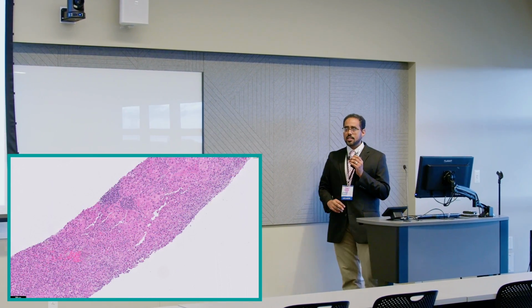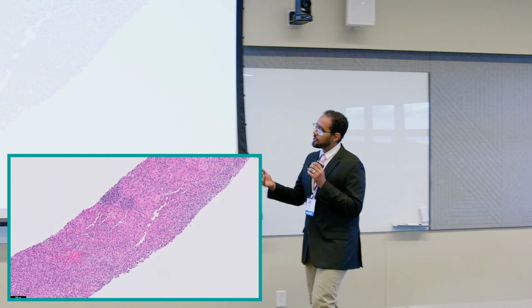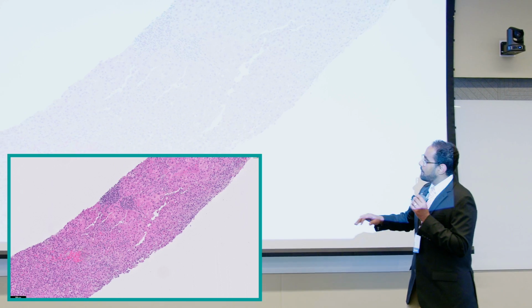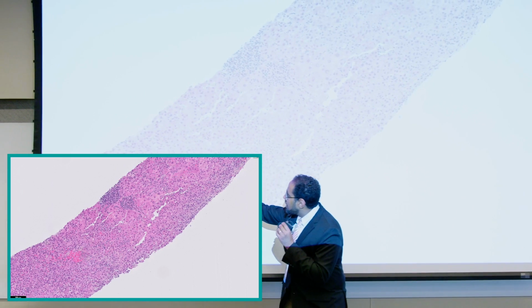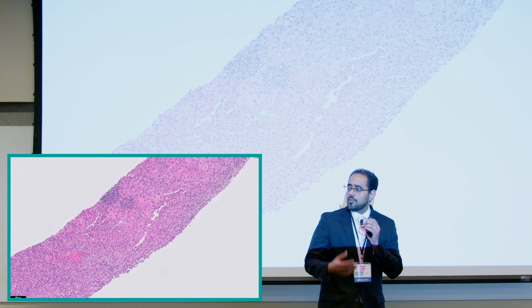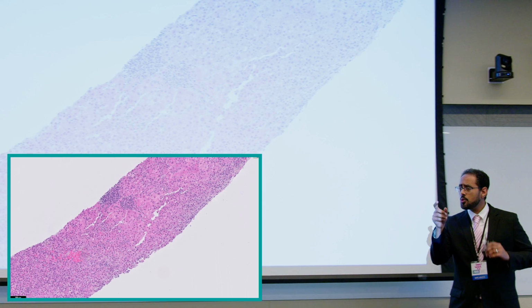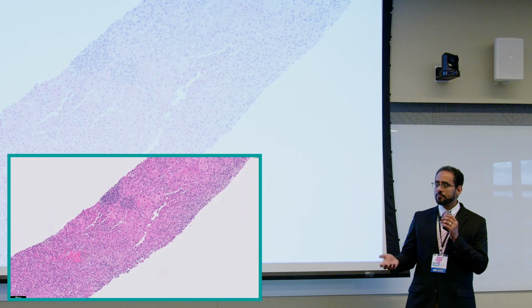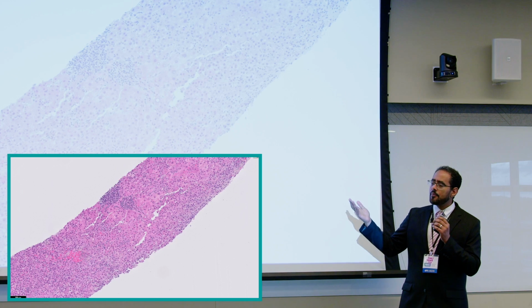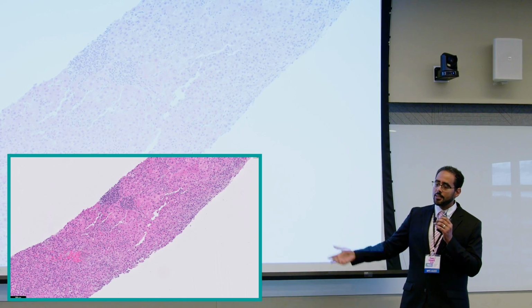When the inflammation is so bad that it damages a lot of the liver cells in the lobule, you start to have collapse of the structure and empty spaces, all filled by inflammation or some blood or necrotic tissue, like this. This is a lot of empty spaces where you don't see normal liver. So this is the severest form, severe activity. And usually the patient is very sick at that stage. But the liver has a very good regenerative ability most of the time, and that does not mean this will get fibrosis, but this is a severe activity at presentation.